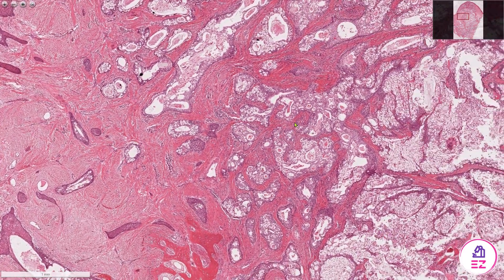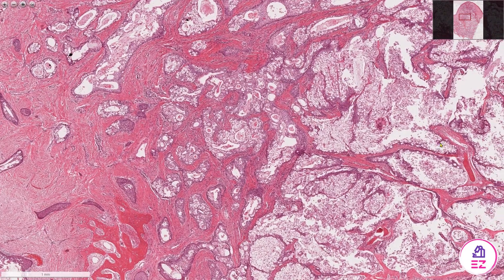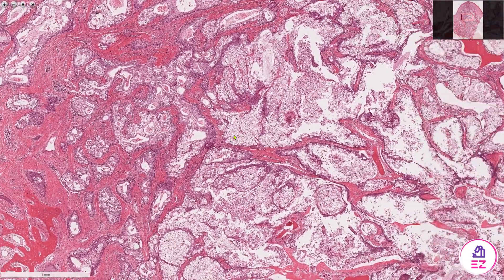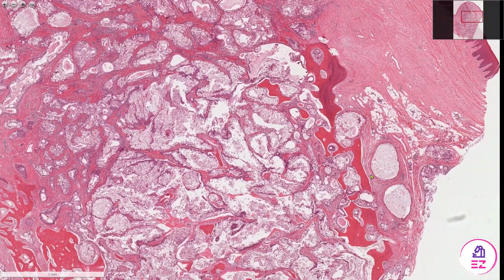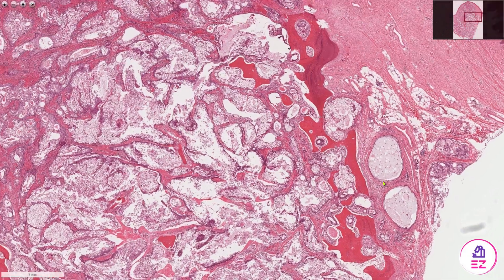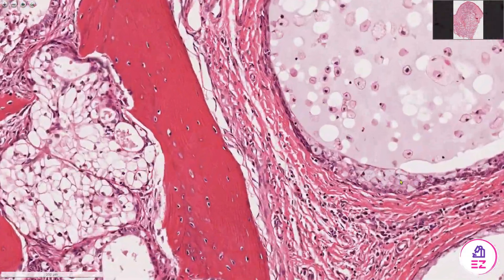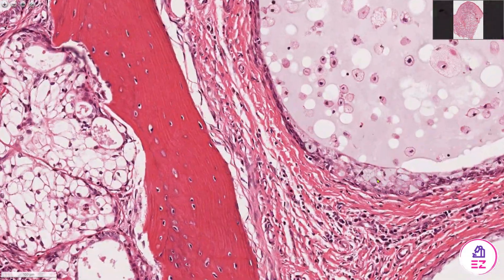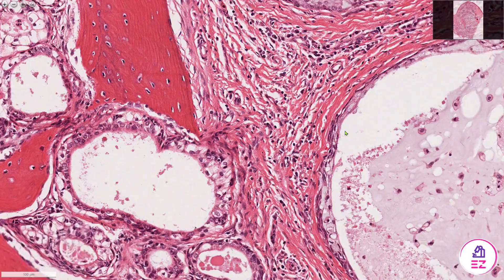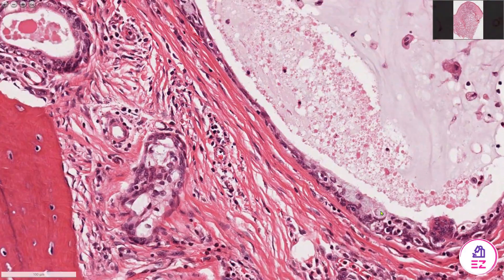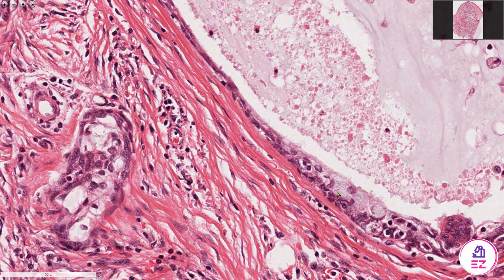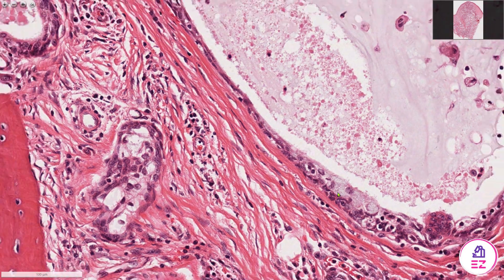There are key cells to look for in a mucoepidermoid carcinoma which I'm going to go through now. If we take these two cysts here, we can see mucous cells lining these cysts. The mucous cells are these pale foamy cells.